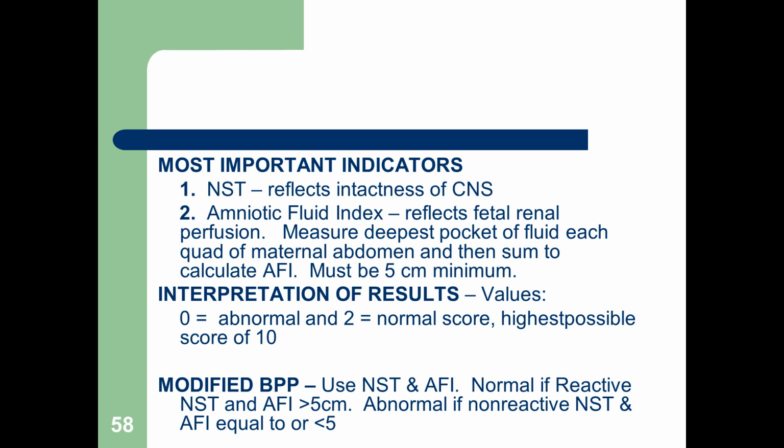Measure the deepest pocket of fluid in each quadrant of the maternal abdomen, and then sum to calculate the amniotic fluid index. Again, that's another means of fetal well-being, and again, it would probably determine what's going on with the mom and what they anticipate with the baby. But, you know, when you see adequate fluid that's not green or brown or anything, that means the kidneys are working pretty good. Okay?